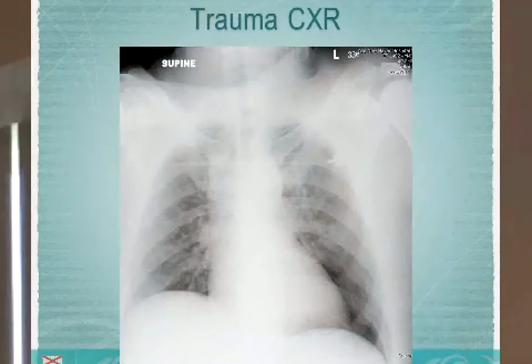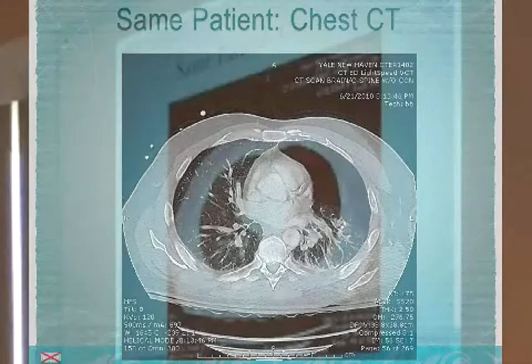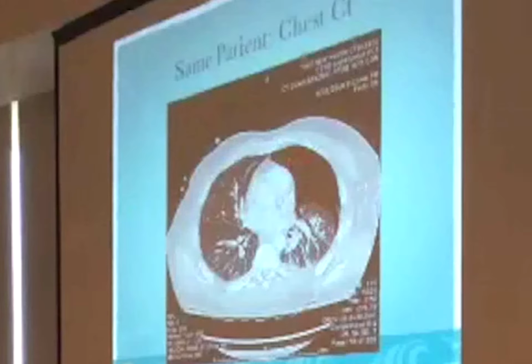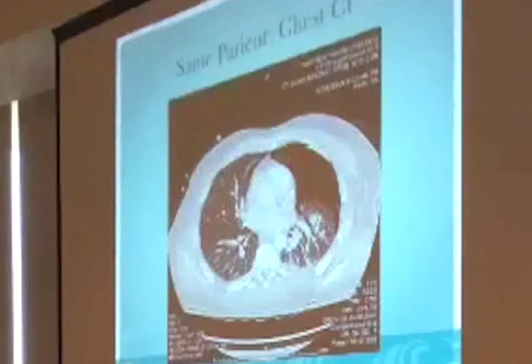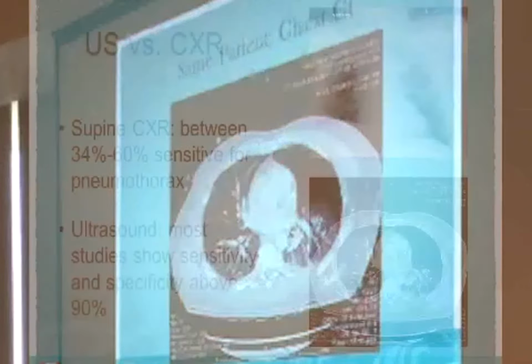This is a real chest X-ray from a real trauma patient that was lying supine on a table. And who's going to call a pneumothorax here? Like, who's going to go and put a chest tube in right now? On this? No one. Even though it's obviously a trick question. That's the same guy. Big pneumothorax. Just happens to look like lung markings are going all the way to the edge because looking from anterior to posteriorly, they are. So you would see that with ultrasound, you wouldn't see that with chest X-ray.